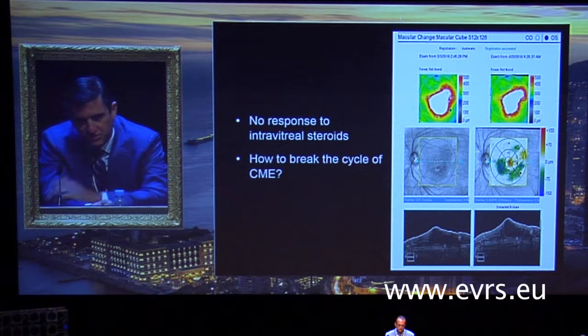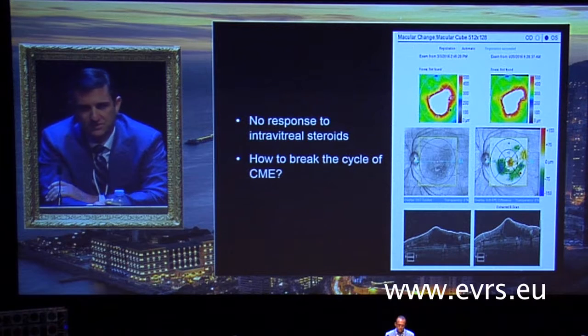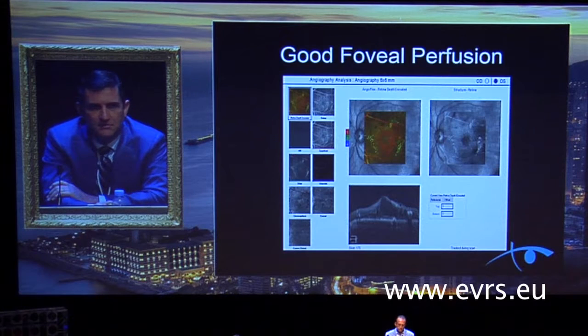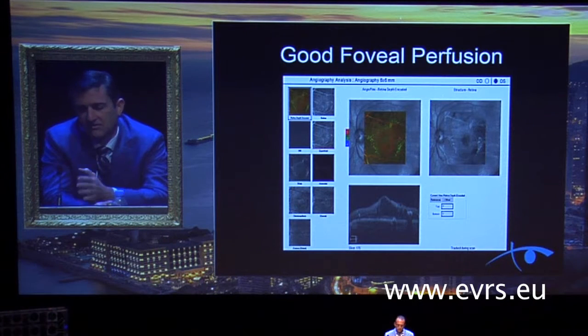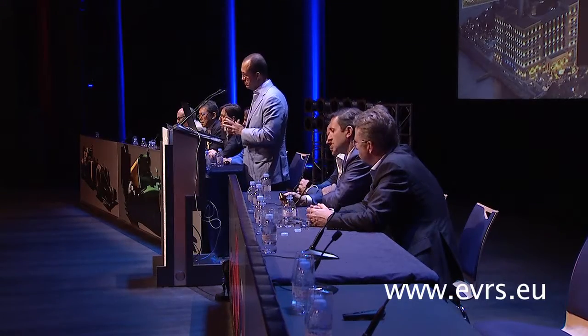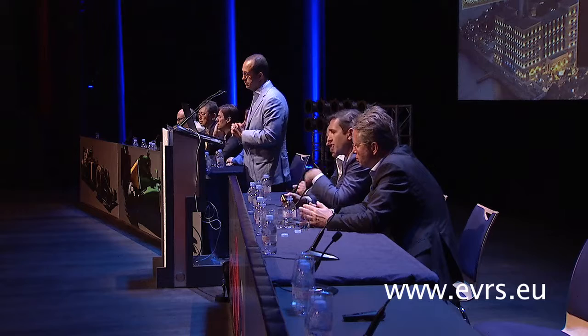also got intravitreal steroids. And you can see here the pre-steroid and the post-steroid image, which are basically the same. And the question in a lot of these cases with CME is, what's happening to the initial vasculature, and can we just break the cycle in one event that can then maybe sometimes allow us to treat the patient with less treatment going forward.